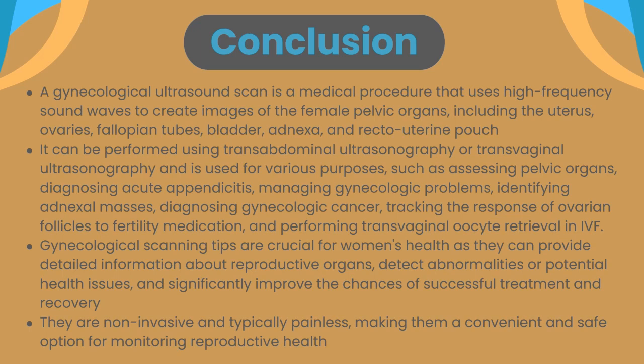It can be performed using transabdominal ultrasonography or transvaginal ultrasonography and is used for various purposes, such as assessing pelvic organs, diagnosing acute appendicitis, managing gynecologic problems, identifying adnexal masses, diagnosing gynecologic cancer, tracking the response of ovarian follicles to fertility medication, and performing transvaginal oocyte retrieval in IVF.